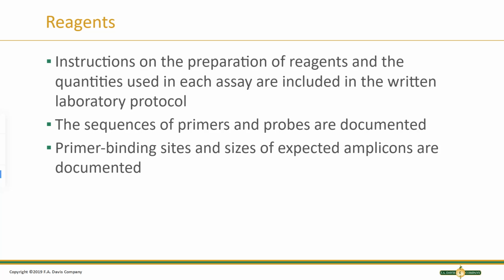Reagents. Instructions on the preparation of reagents and the quantities used in each assay are included in the written laboratory protocol. The sequences of primers and probes are documented. Primer binding sites and sizes of expected amplicons are documented.